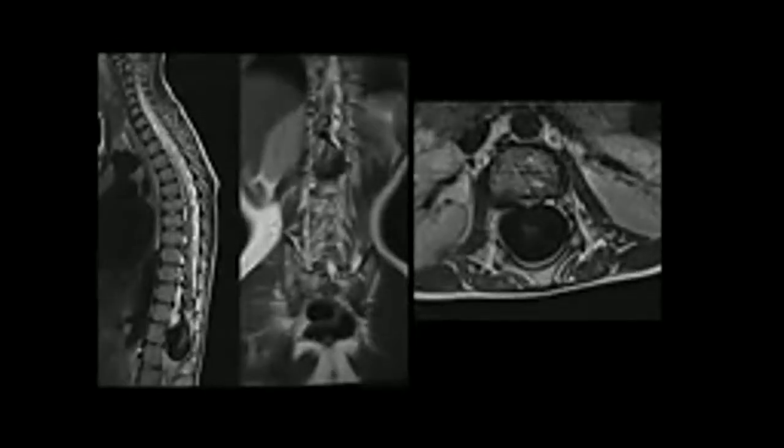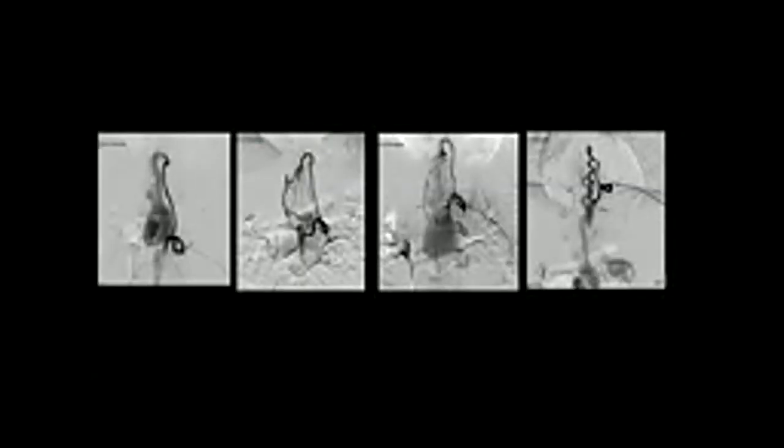And for the fistula case, again, instead of using the liquid, from time to time I'm using coil. This is the case. The multifeeder is feeding the fistula, type 4C. And I choose, of course, the posterior medullary artery, this one, to go there, not the anterior one. And I put the coil. Look at the coil, it's filling the sac. And I call it a total occlusion.